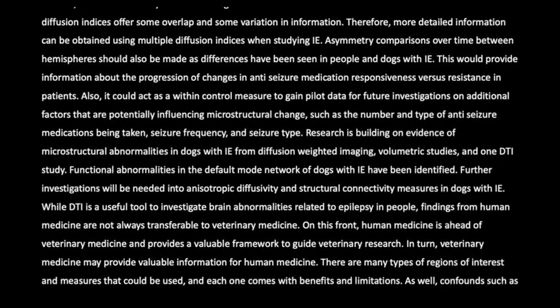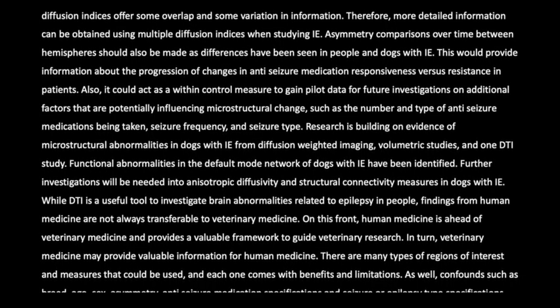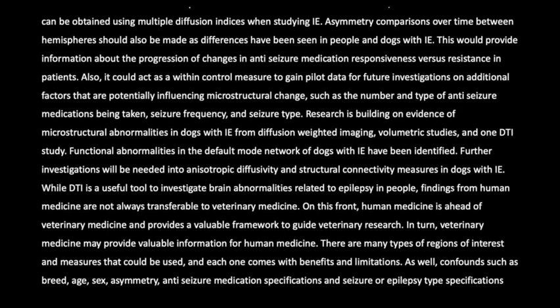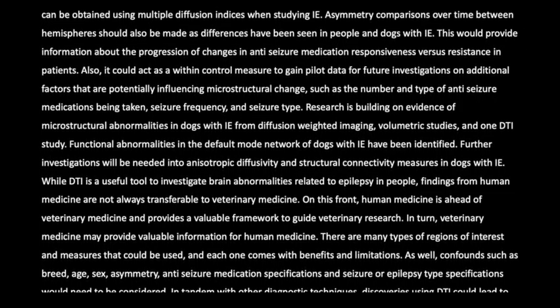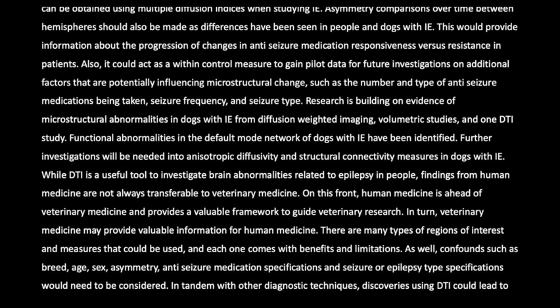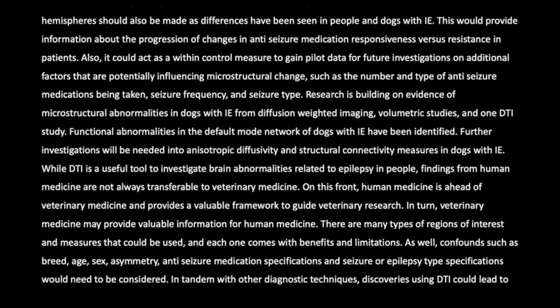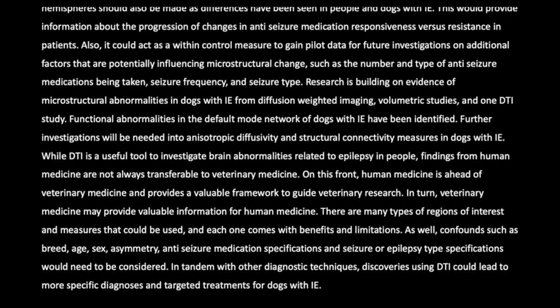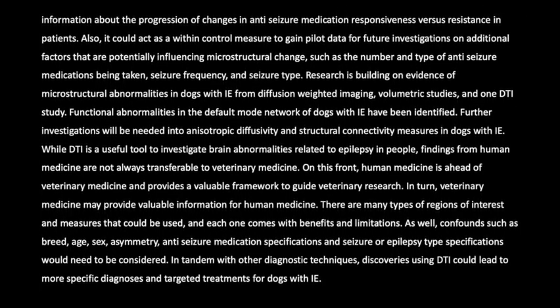Research is building on evidence of microstructural abnormalities in dogs with IE from diffusion-weighted imaging, volumetric studies, and one DTI study. Functional abnormalities in the default mode network of dogs with IE have been identified. Further investigations will be needed into anisotropic diffusivity and structural connectivity measures in dogs with IE.